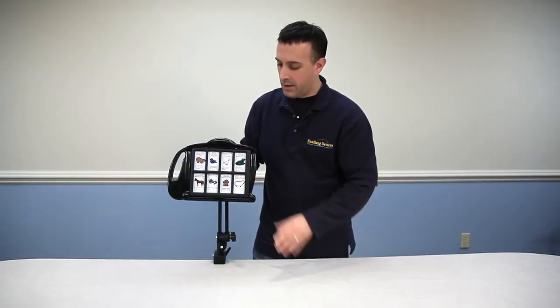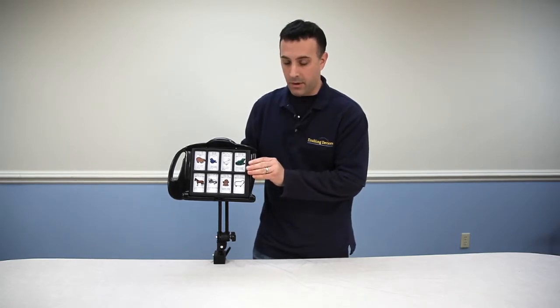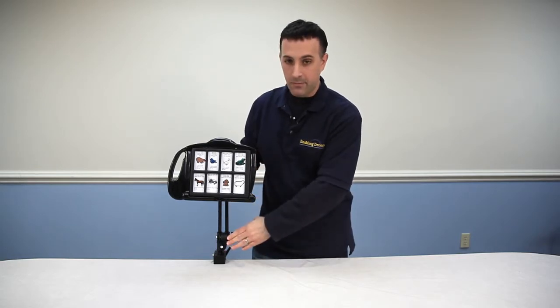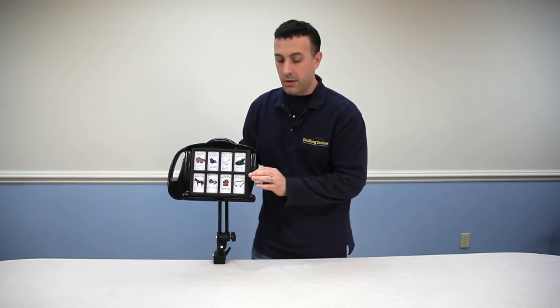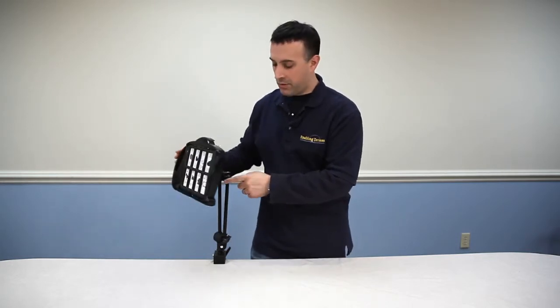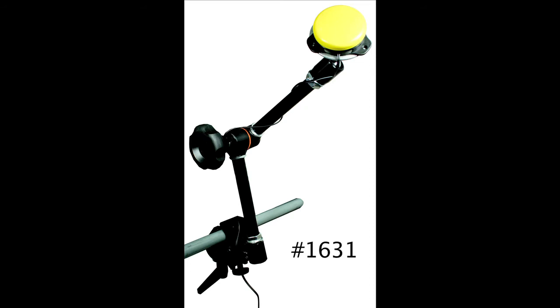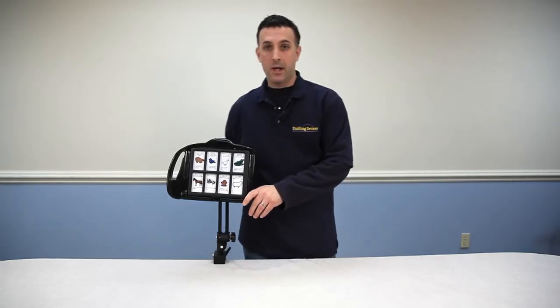This concludes our video on the new mountable 7075X. It comes with the 7-Level communicator, the mounting bracket, the arm, and the clamp. Or, if you have your own mounting arm, you can purchase the number 7075M, which is just the communication device with the mounting hub on the back. This will work with our light-duty magic arm if you currently own that, or our heavy-duty magic arm number 1631. These items can be purchased on our website at enablingdevices.com, through our catalog, or by phone at 1-800-832-8697. This is Vinny Lavoie for tech support at Enabling Devices — I hope you enjoyed our video and come back soon.